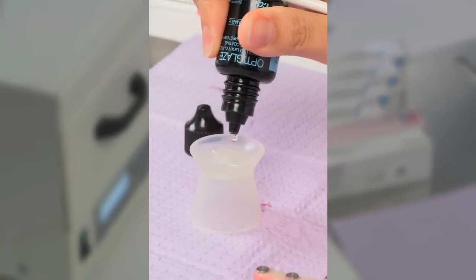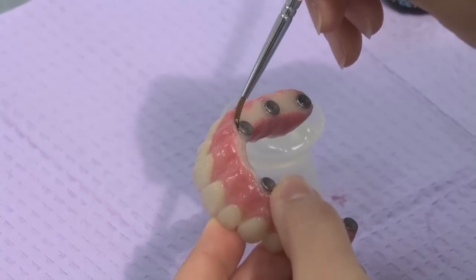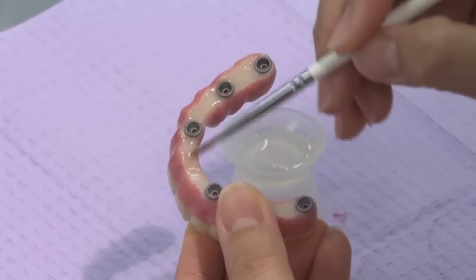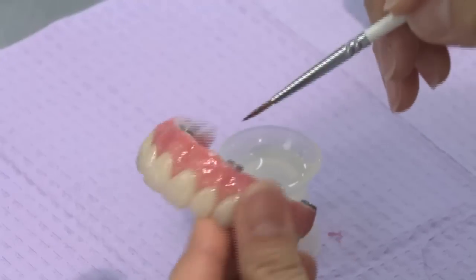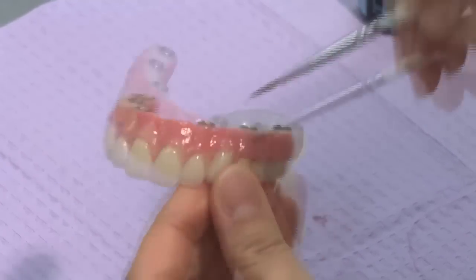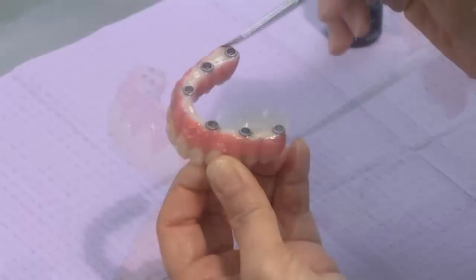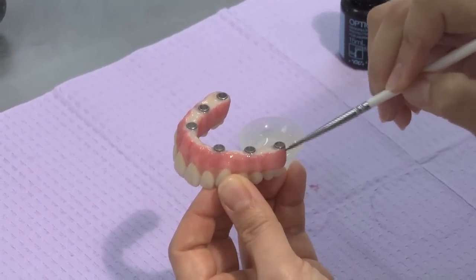Optiglaze is used for the glazing step. Optiglaze is a light cure protective coating from GC America. It is very important that there are no glaze bubbles on the appliance. To make sure this does not happen, completely submerge your brush in the glaze and make sure it has plenty of liquid. The less liquid on your brush, the higher chance that a bubble will be formed. Create a clean glaze across the entire appliance.